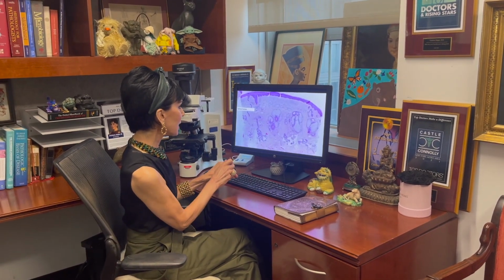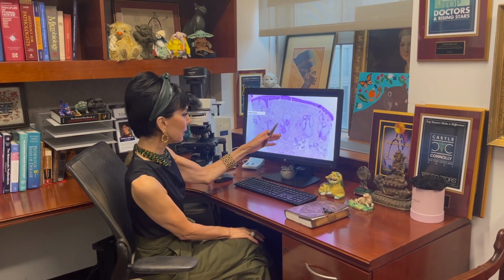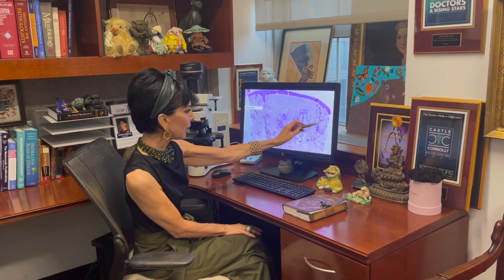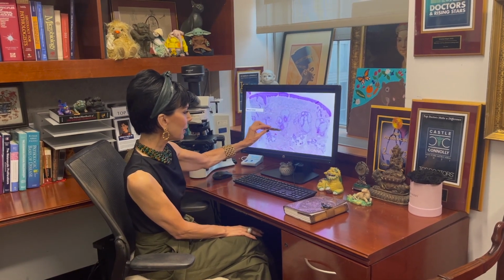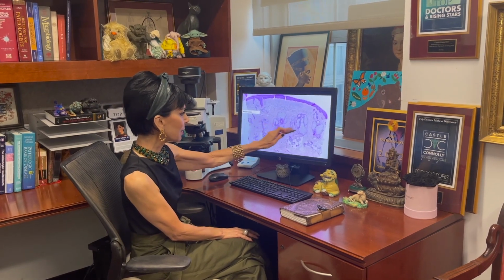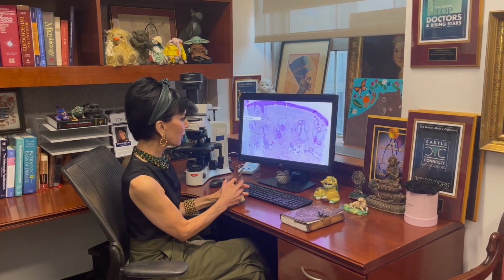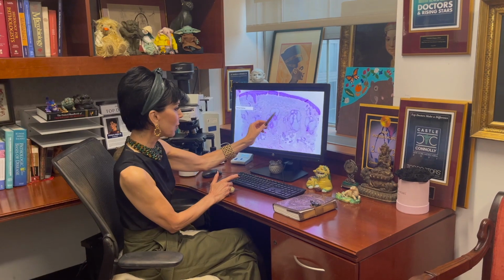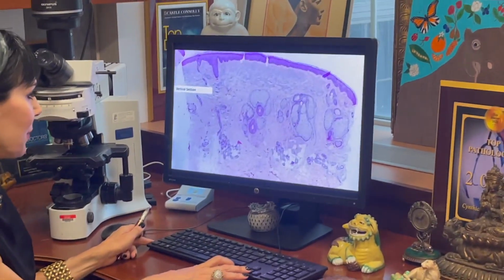This is the vertically sectioned scalp biopsy, and it basically shows the same fundamental process as what we gleaned on the horizontal section scalp biopsy, which is that the hairs that are present are smaller hairs situated in the superficial and mid dermis. Sebaceous glands are intact, there is no inflammation, so it is a non-scarring alopecia where the alopecia is attributable to this type of vellus type hair miniaturization.